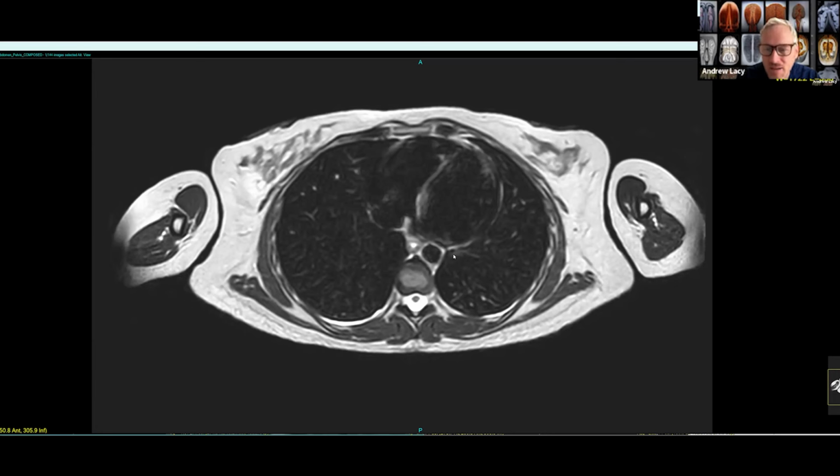There's a head and torso scan where we add a little bit higher resolution imaging, I believe, in the pelvis, and then we also add the head and neck to that. And then the comprehensive exam also adds the legs, and importantly, we do a detailed spine evaluation as well. Is that a fair assessment? What did I miss? Yeah, that's pretty accurate. The torso can be a little confusing to people because it's chest, abdomen, and pelvis. And like you said, I totally agree. The vast majority of cancers that we're probably going to detect are going to be in that area. And so those are the main differences.